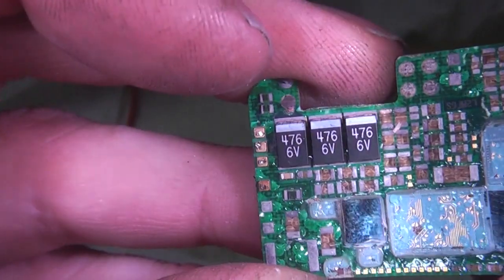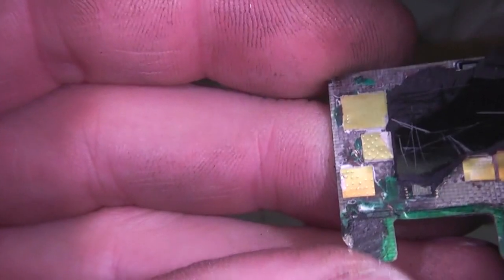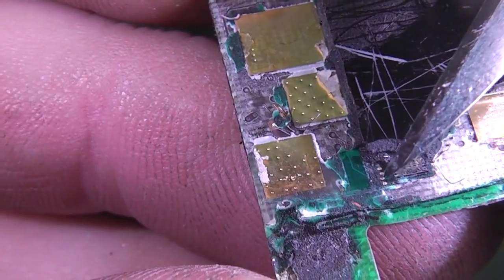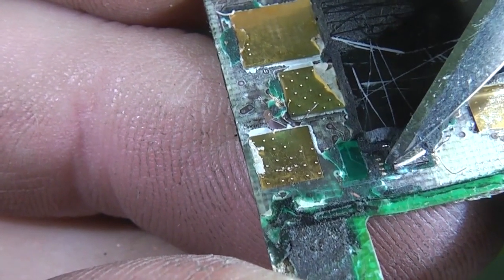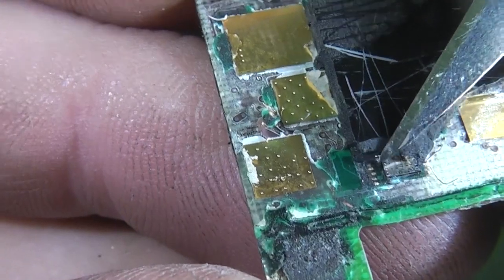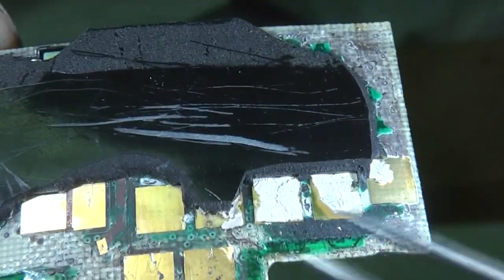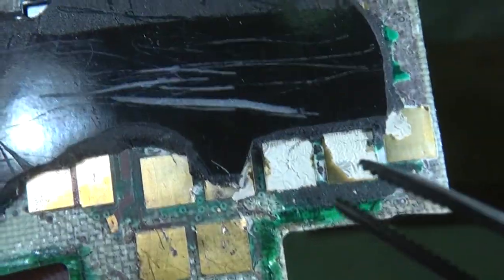It's a little bit hard to see exactly how this is mounted. I mean, there's one over here where it looks like it's been wire bonded. It's either been wire bonded or the actual chip, yeah, it's actually got bumps on the chip directly onto the PCB. I think I have to strip it down a bit more to figure out. A lot of these devices here appear to be power semiconductors. I'll stick them under a microscope in a minute to take a closer look, but you can see from the structure that they're sort of FET or something similar rather than ICs, because of the level of detail.